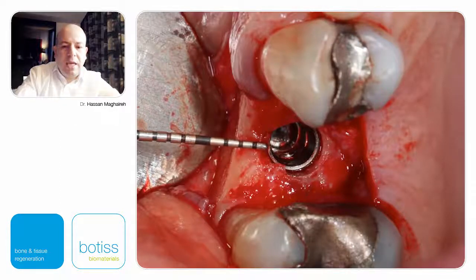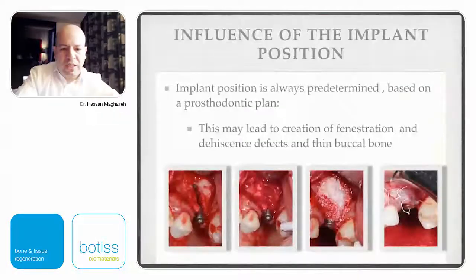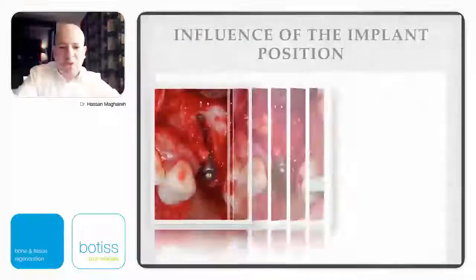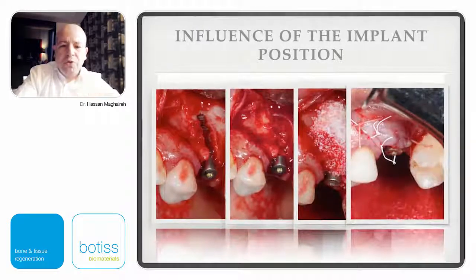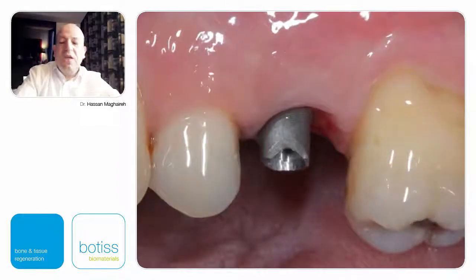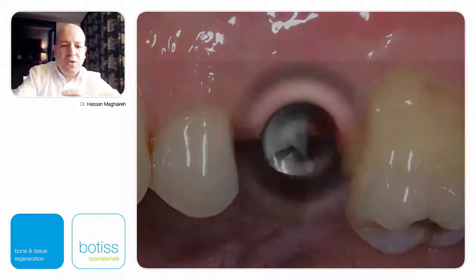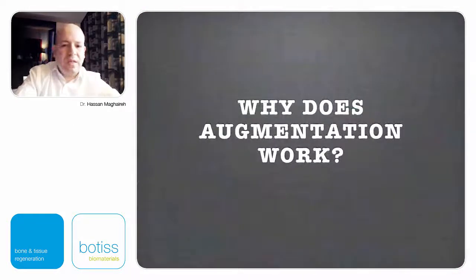In this case, it's a premolar. We have 2.5 millimeter thickness. Definitely GBR is not needed in this case. In another case, you could see the whole thing exposed. Maxgraft, xenograft, and then get this, the convexity you want. And from there, you build, you do your GBR successfully. You wait, you do your temporary crown at the second stage, you do your final crown at the final stage, and you could appreciate you have managed to get a good pink aesthetic score around this dental implant, and then it was easy to achieve white aesthetic results.